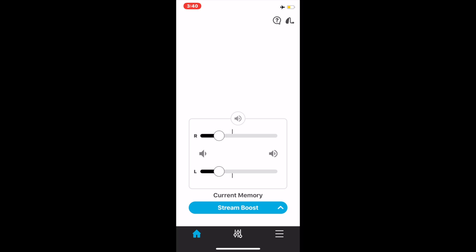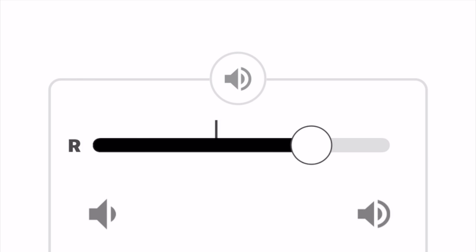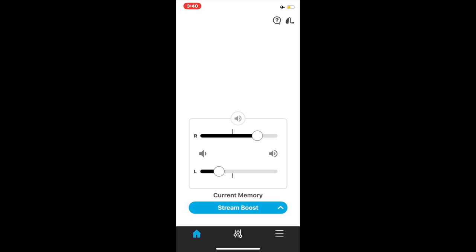At the bottom, you will see the box to adjust the volume control. By pressing and moving one circle, you can adjust the volume for one hearing aid.